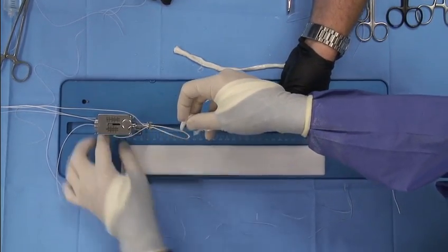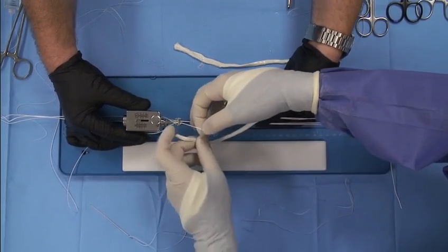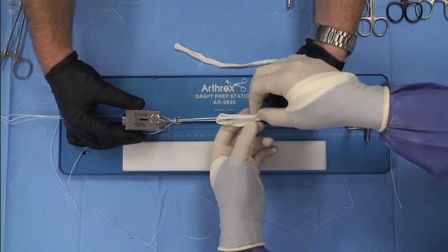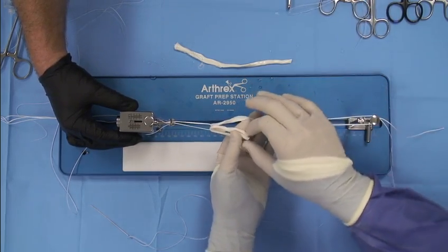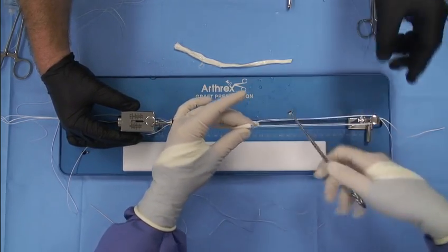And now I'm going to pass it on the femoral side, and we bring one limb in one direction and the other limb in the other direction so that now you see I'm going to have a shorter and quadrupled graft. You can see how it's coming through. And now what I'm going to do is actually pass one of the limbs through the loop so they're on the same side.